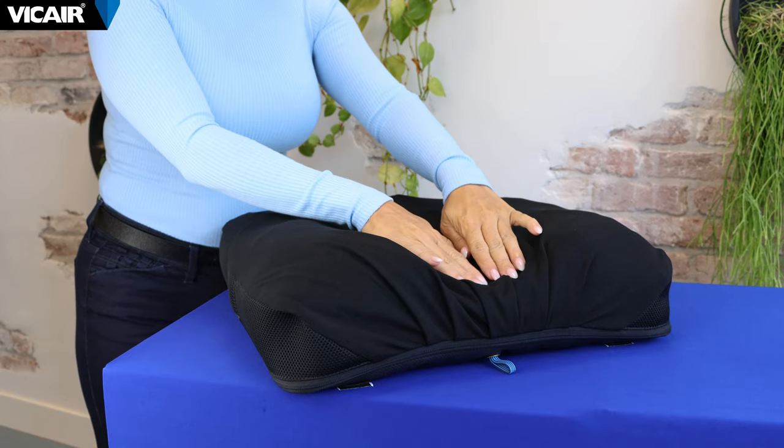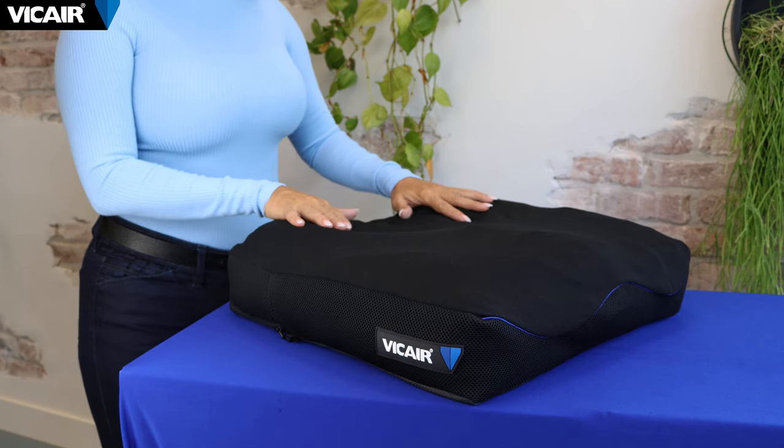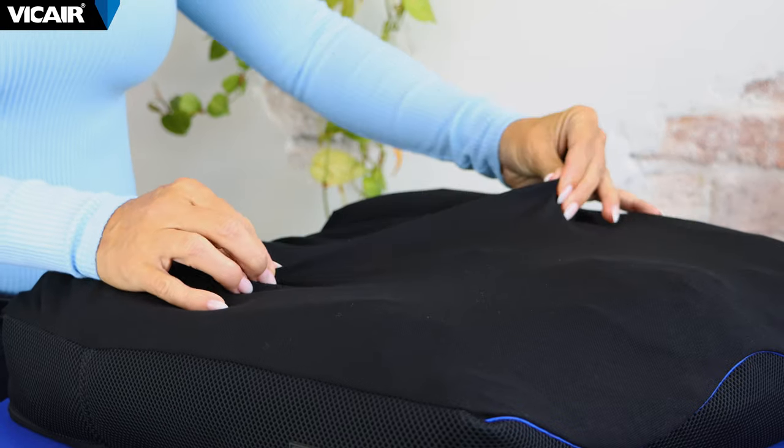The Vicair Comfair cover is made out of multi-dimensional stretch material and has small pleats at the rear side of the cushion. The design facilitates optimal immersion and envelopment. The breathable fabric is designed for air transmission, heat, and moisture dissipation.